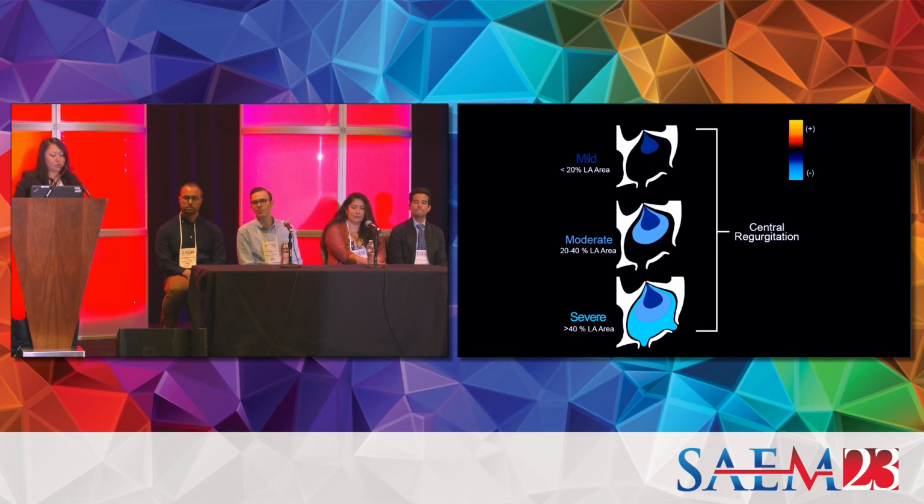So mild mitral regurg, you often have a smaller jet, and you really only have less than 20% of left atrium being filled with a regurgitant jet.